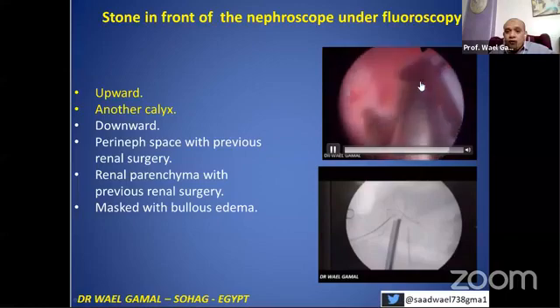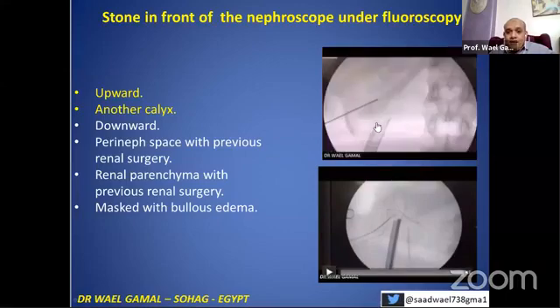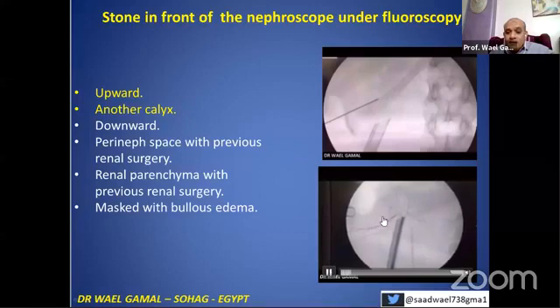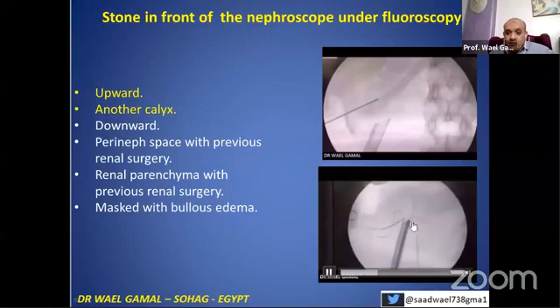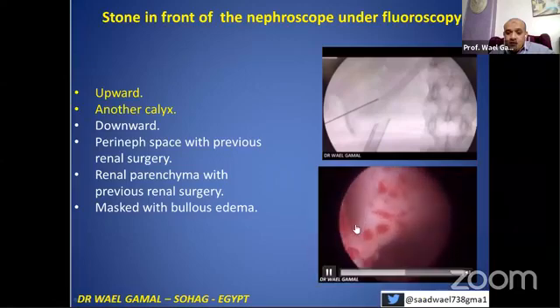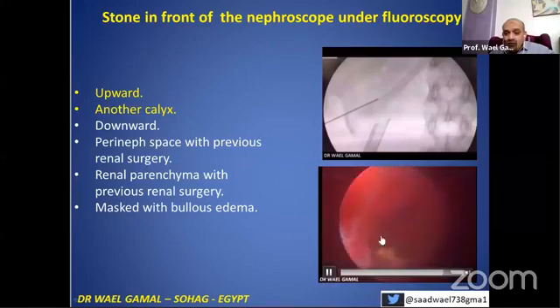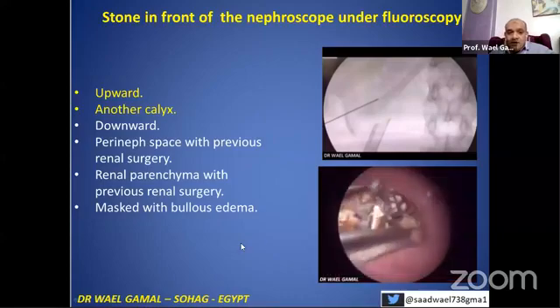The stone is pushed from this perpendicular area. Another situation: stone in front of me, but unfortunately I don't see it. The stone is sometimes in another calyx, so you can push it to save an extra puncture. Here we push the stone — the stone is pushed. This is the picture from inside. We try to manipulate the stone with the needle from this calyx, and we are lucky to deliver the stone and save another access.